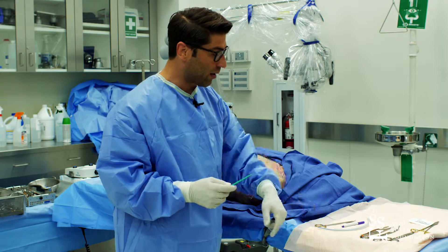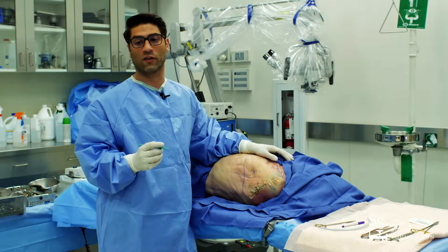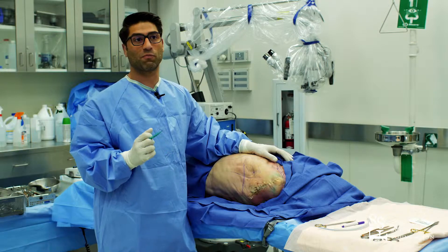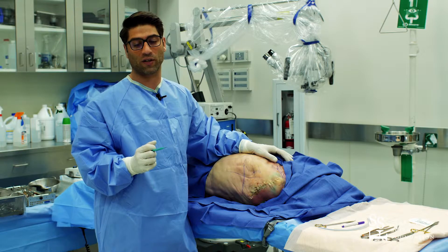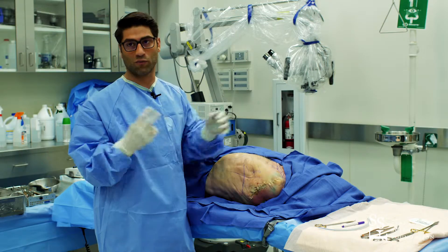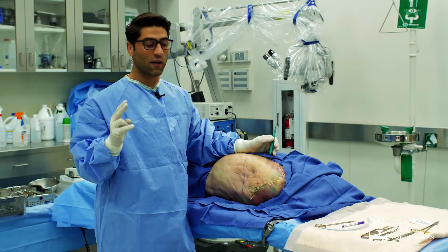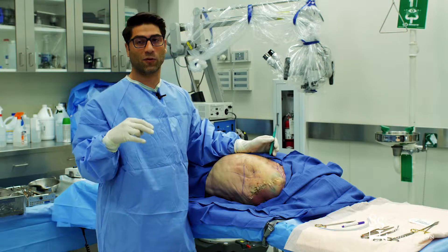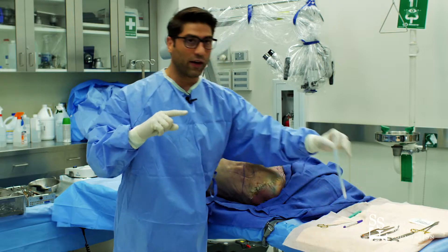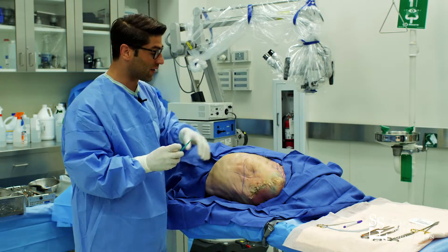A common mistake, especially in the beginning, is that you do the skin incision too small. The skin incision should be as small as possible but as big as necessary. In the beginning, do the skin incision a little bit larger because it's easier to put in two fingers — you need space for two fingers, because once you're through the subcutaneous tissue, you need one finger as guidance and the other to guide the chest tube. With just a small space it's very difficult and takes more time.